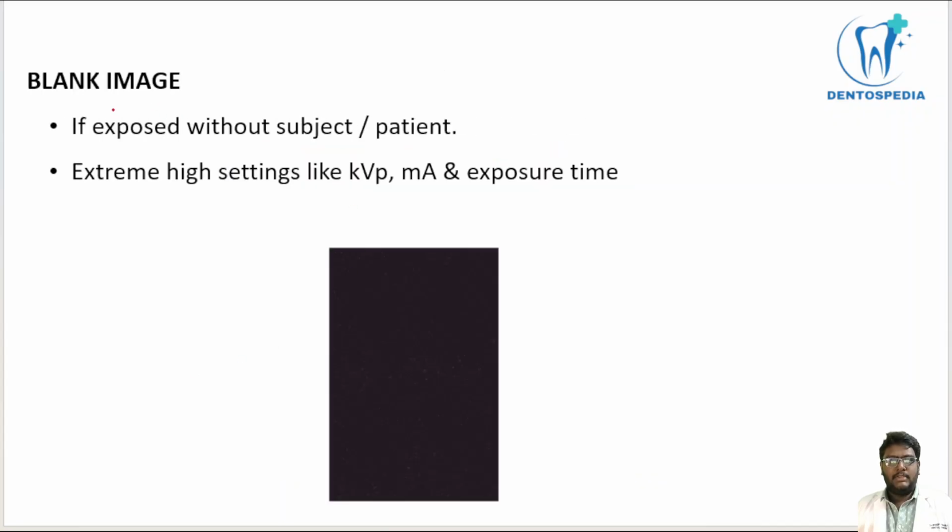And coming to the blank image, if the film is exposed without a subject or patient, and then we develop the film, we will get this kind of radiograph. And similarly, if we use high kVp and mA settings, we will get this kind of radiograph.